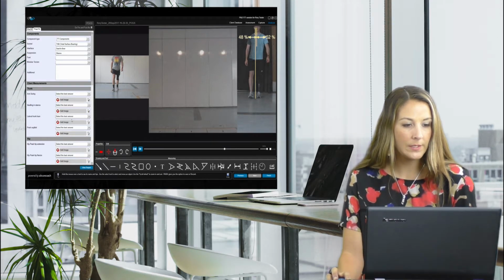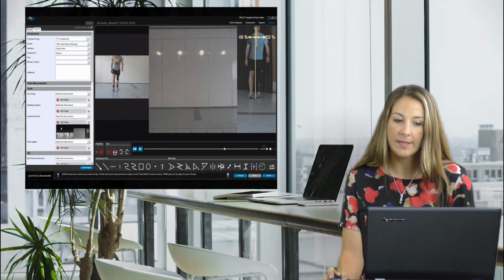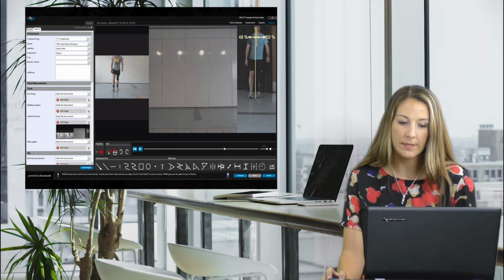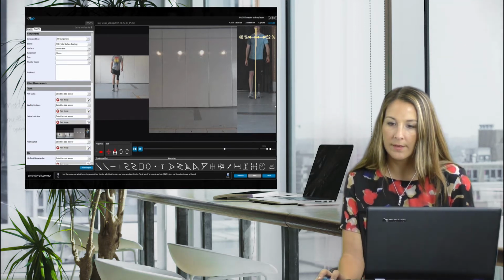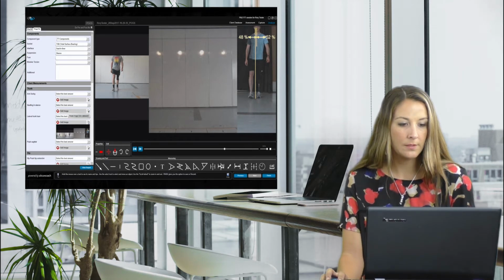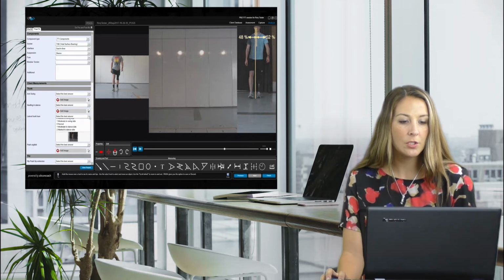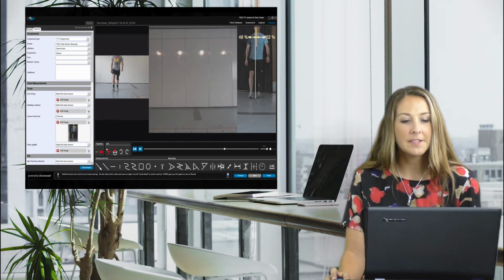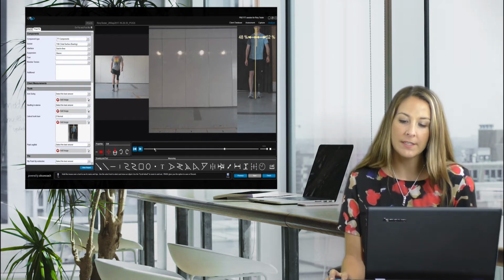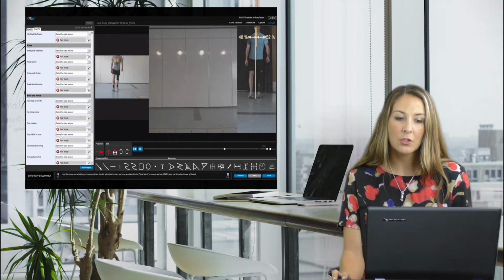So that will go into the lateral trunk. Oops, we took a big image. So if we don't like the image that we got, we'll just go ahead and click our tool again. And we'll try that again. And we'll hit, and we get that better image. So we'll choose that he is pretty normal now. He's got a normal lateral shifting. So again, we'll just go through all of those measurements on one side.